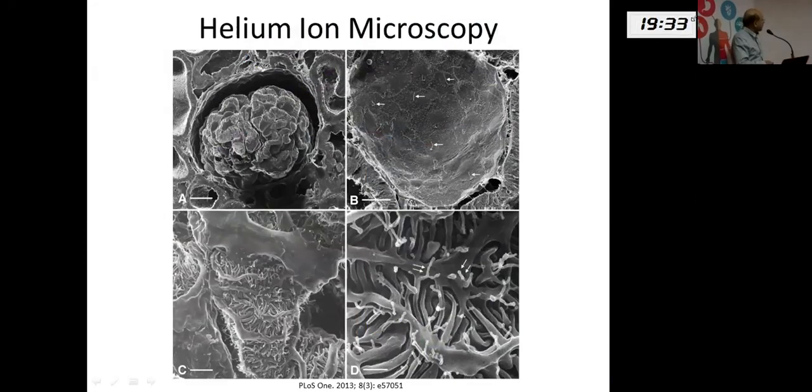The glomerulus and its structure, rather like a tiny little cabbage. And if you peel that away, you would find a cup, which is actually the Bowman's capsule. And if you look carefully on the surface, further magnified, you can see interdigitating processes that we talk about. And even further, that these processes that interdigitate further have interdigitating processes which I have never ever seen before searching for information for this particular talk.